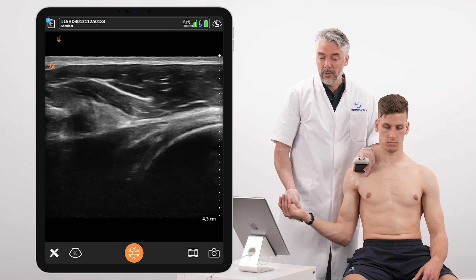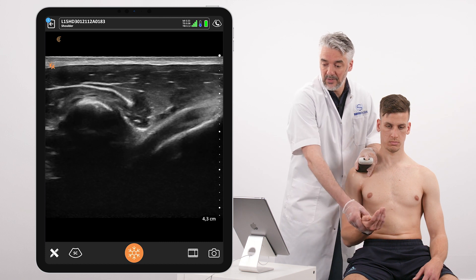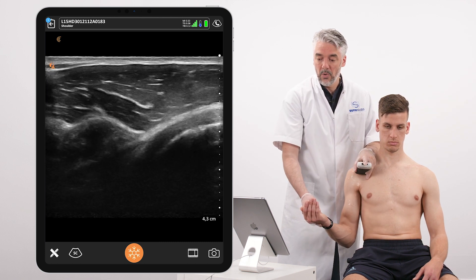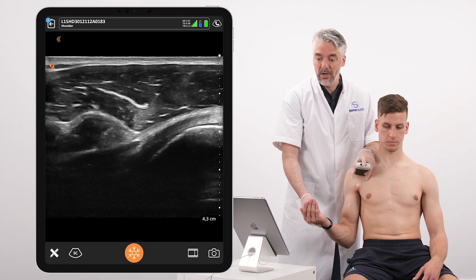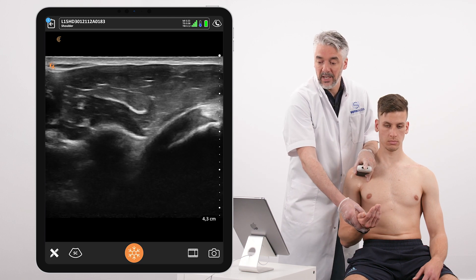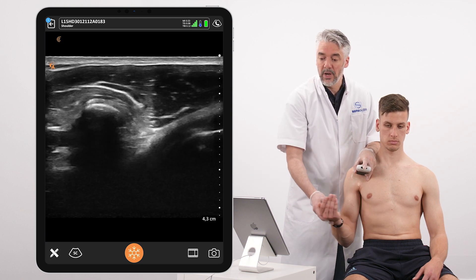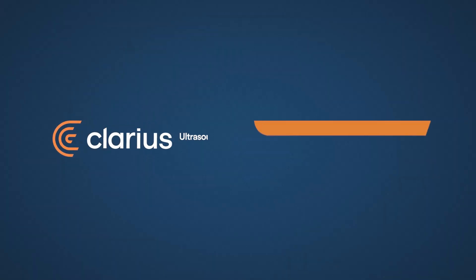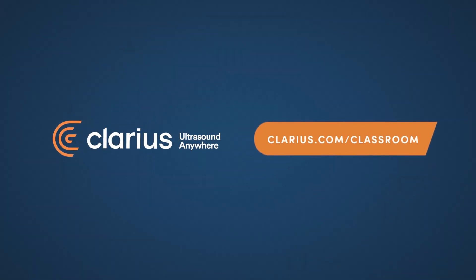Not only do we look at the level of the bone, but also slightly lower where we can observe the interaction between the subscapularis, the coracoid process, and the coracobrachialis muscle.